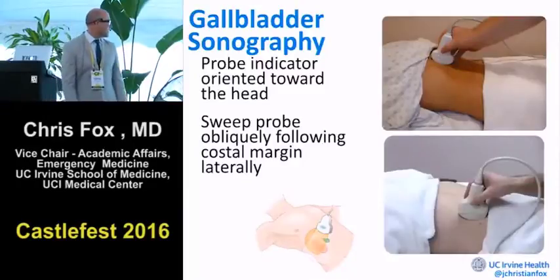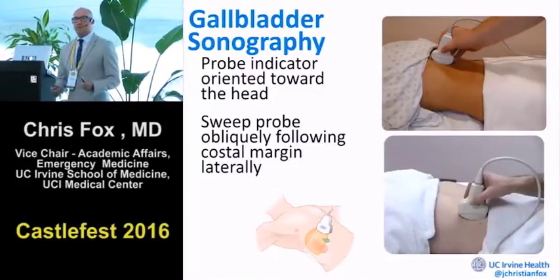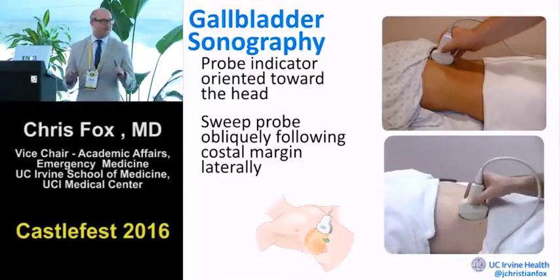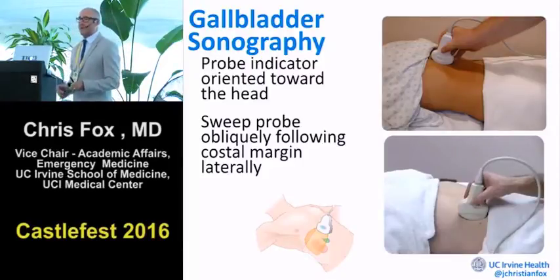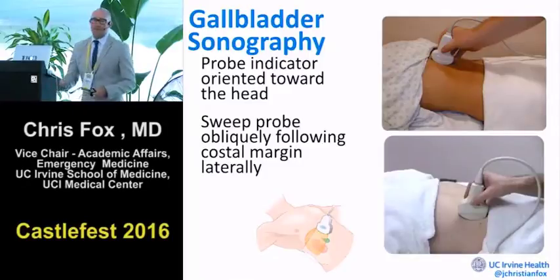So, the way you do the Gallenblase ultrasound is I like to start with the big curvilinear transducer. Whenever I can get away with using that big, fat, curvilinear probe, I think of all the probes, that thing always gives me the sickest image. So I will try to get away with that whenever I can, and this is a wonderful place to start here. Even if you have a patient who's really big, hey, if they're doughy, you can push in on them, and as they take a deep breath, you'll be able to see their gallbladder.